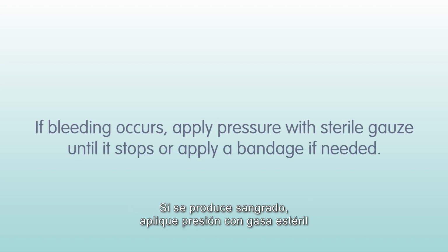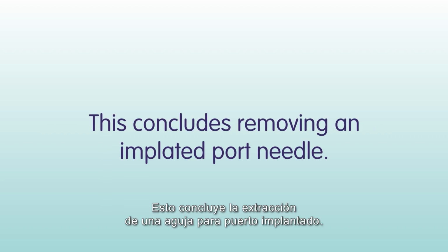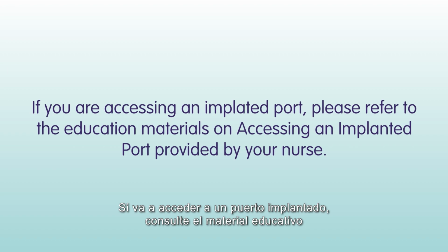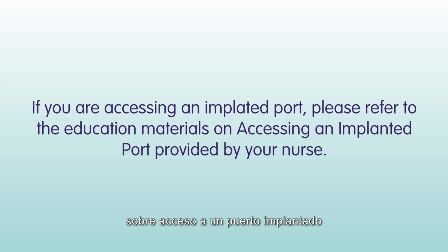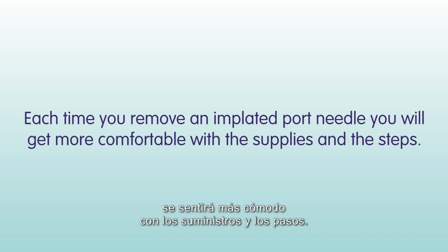If bleeding occurs, apply pressure with sterile gauze until it stops or apply a bandage if needed. This concludes removing an implanted port needle. If you are accessing an implanted port, please refer to the education materials on accessing an implanted port provided by your nurse. Each time you remove an implanted port needle, you will get more comfortable with the supplies and the steps.